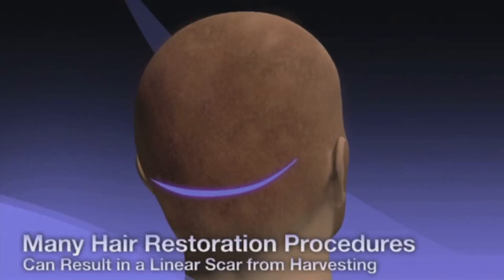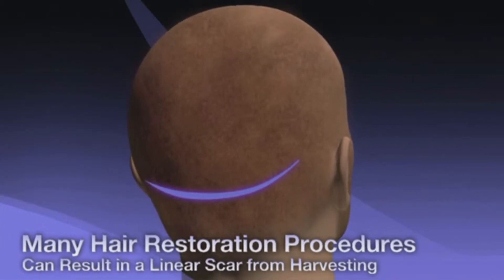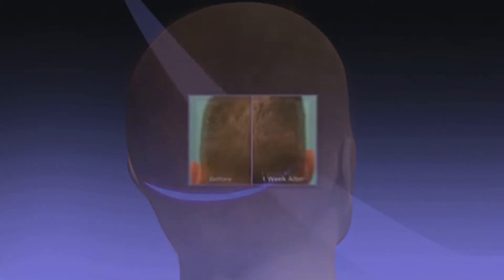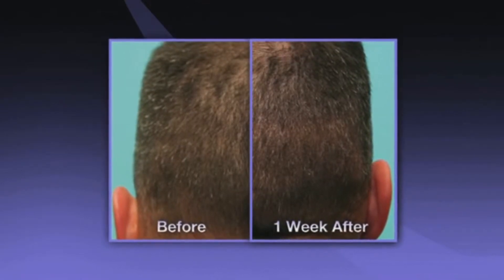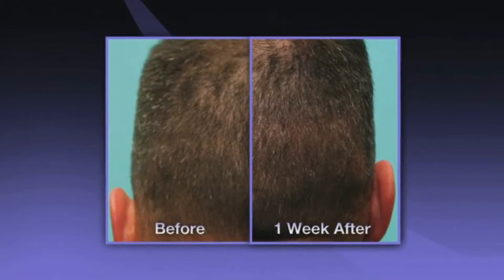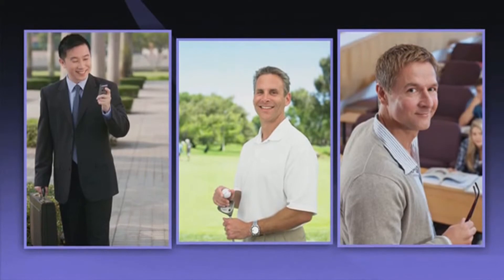Unlike strip harvest surgery, the Artist Procedure requires no linear incisions or stitches. Additionally, the Artist System harvests hair in a natural fashion so that the donor area retains its original appearance, which allows you to quickly return to your active lifestyle. And within 9 to 12 months, you will enjoy permanent and natural results that you can confidently wear in any length or style.